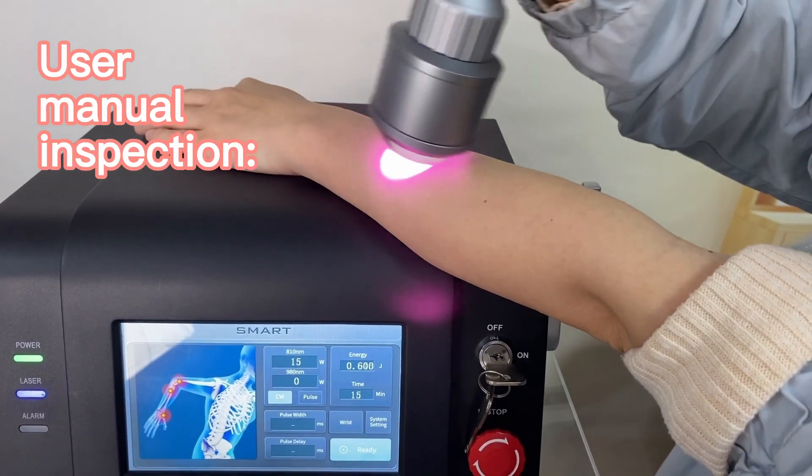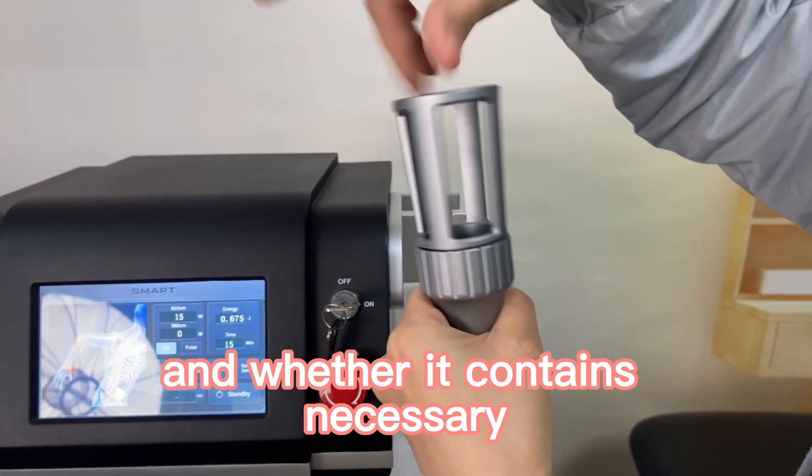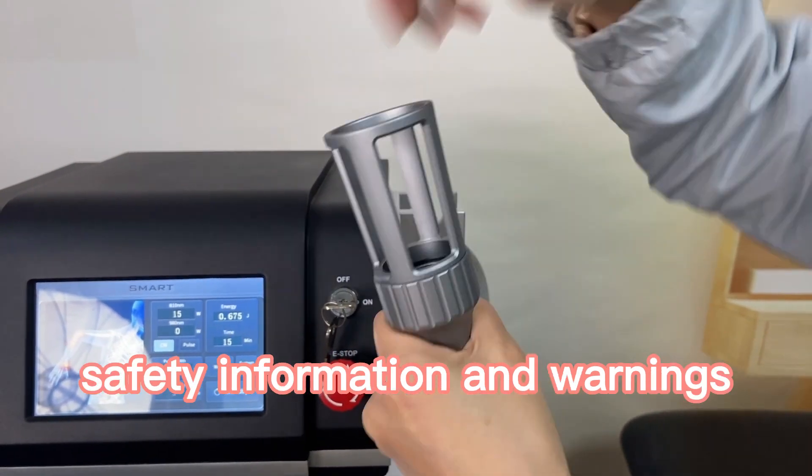Use manual inspection. Check whether the use manual is clear and understandable, and whether it contains the necessary safety information and warnings.